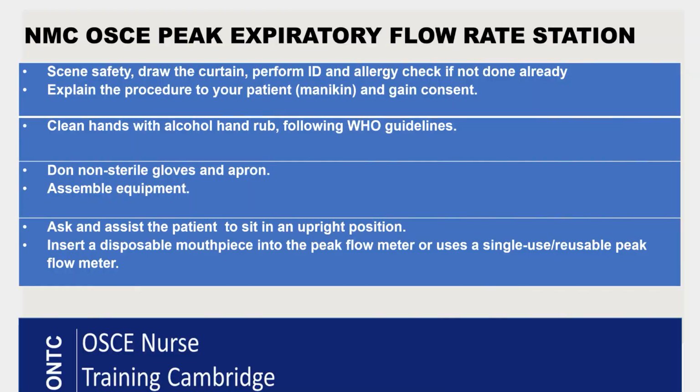So what is our step-by-step procedure? With any station, check scene safety, draw the curtain, and then do the ID check and allergy check against your documentation. Sometimes your assessor will tell you that this has already been completed in your briefing, so you can assume that you have already done it.